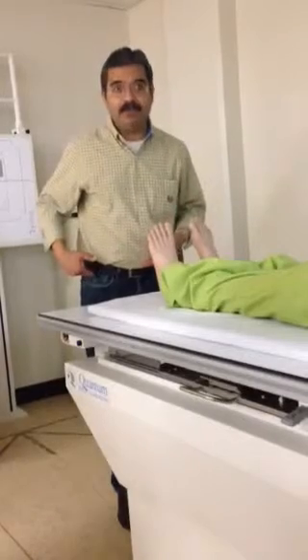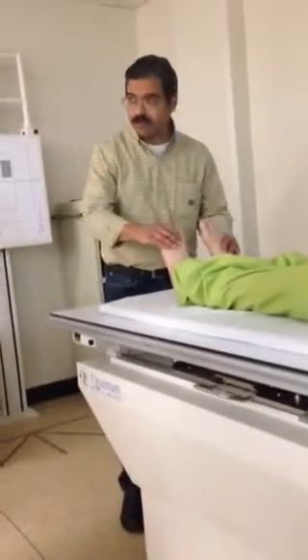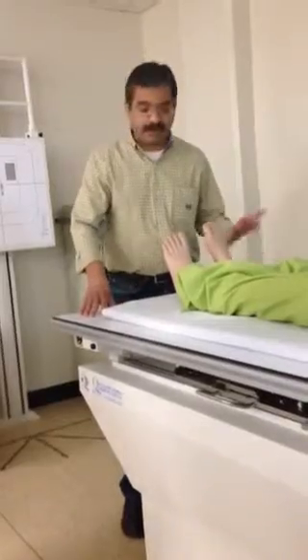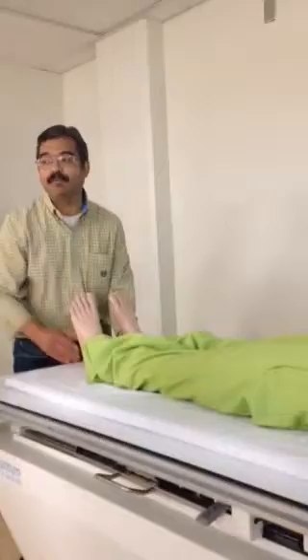If they are complaining of the hip, if they say it hurts, they cannot move the leg, and you have one leg shorter, most likely. If it quacks, it's probably a quack, right? So if you see one leg shorter than the other, it's probably a fracture. So you don't want to move the patient.